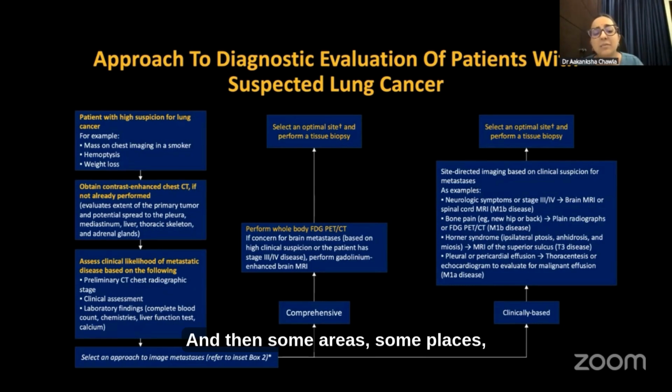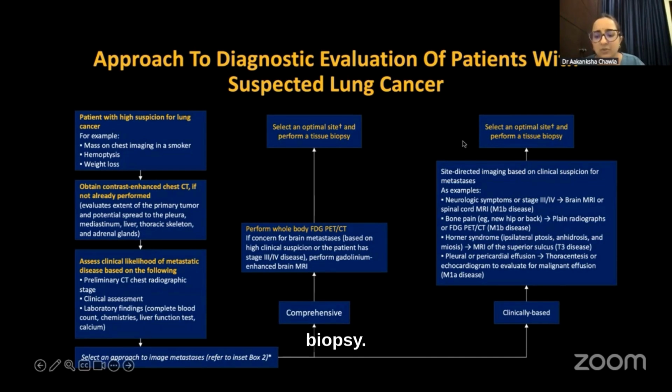And in some places, PET is not easily available. So even in those places, a site directed imaging is more doable and more approachable. Then of course, these imagings also help you to select an optimal site to perform the tissue biopsy.